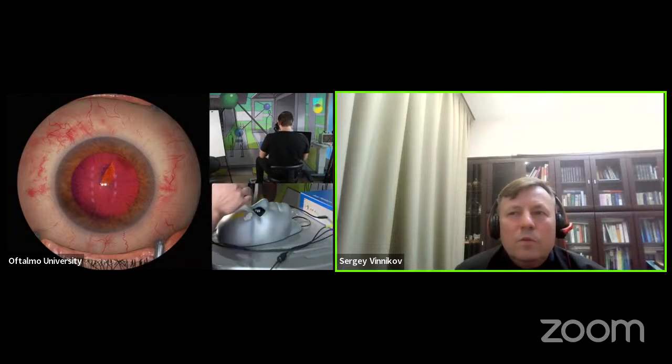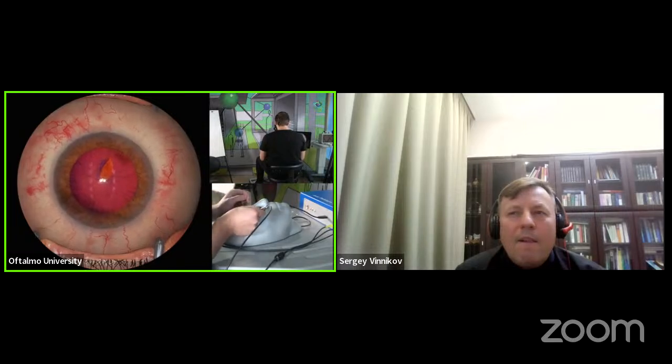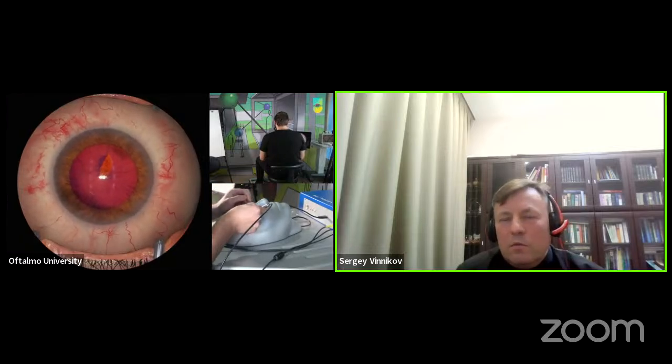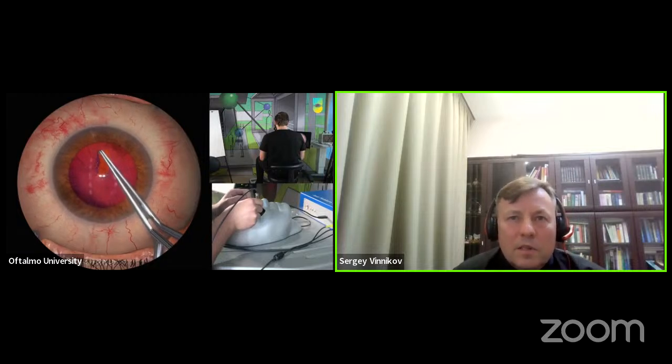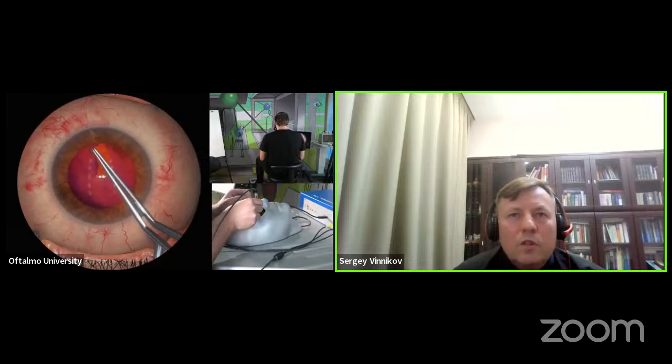Then he's going to apply two rescue maneuvers. First of all, my vector is pointing towards the periphery. So here we have to be very careful, because... deja que se vaya más. Okay. Here. Ага, пинцет. Симулятор пинцета.